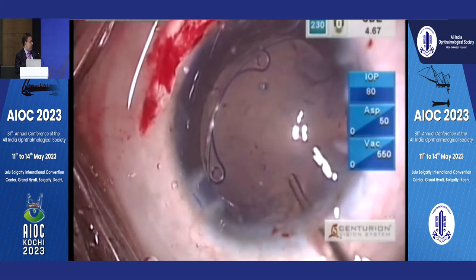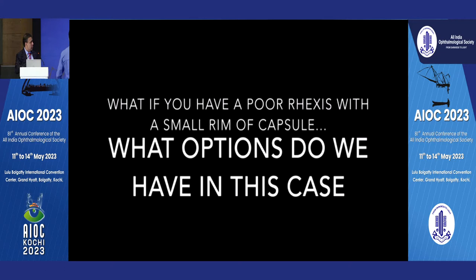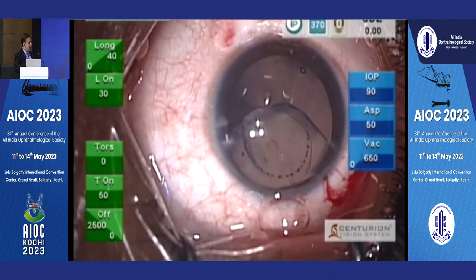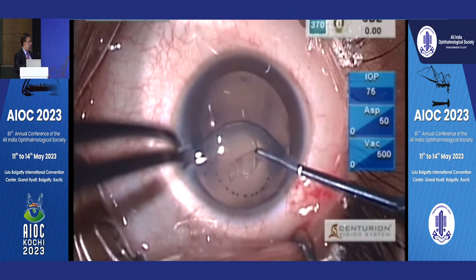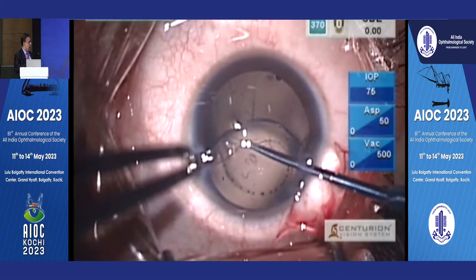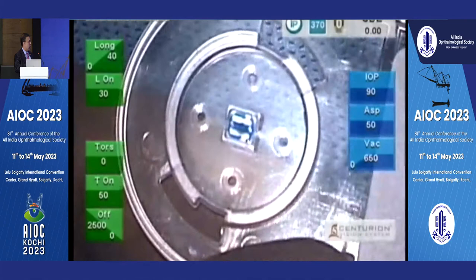In goes the lens. Always tuck in the legs and try to keep the optic outside. What if you have a poor rhexis — a small rim of capsule? When we initially got the laser we weren't very comfortable with it. In one case the laser did punctures in the superficial cortex but didn't open the capsule. There was so much extreme subluxation the laser just couldn't make a rhexis, so I reverted to the trusty forcep. It started running out, but I managed to pull it in by pulling opposite to the direction it was running, and I got it in — so I do have a capsular rhexis, but absolutely at the periphery.